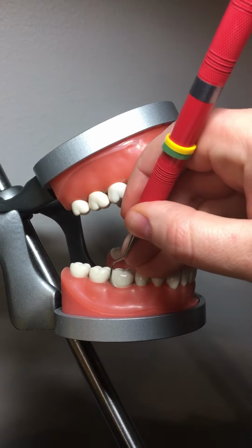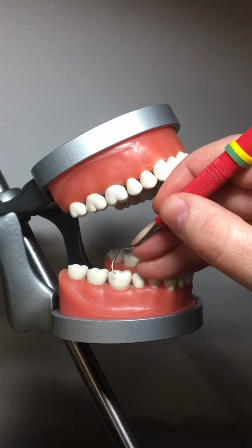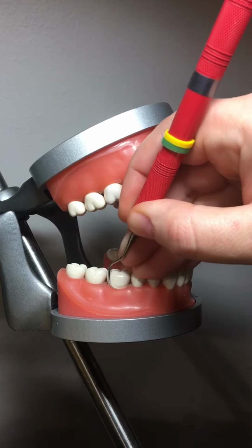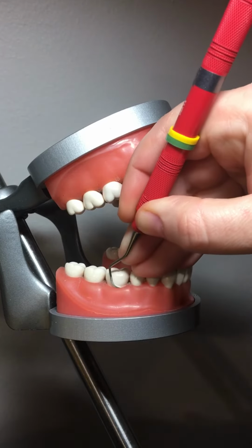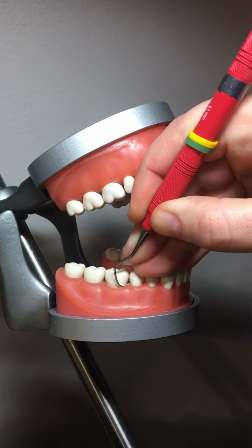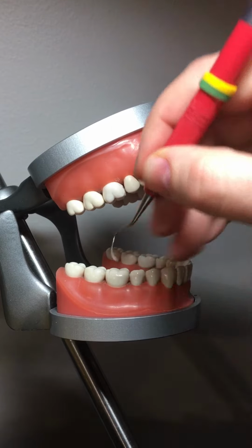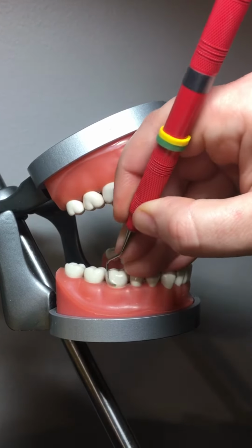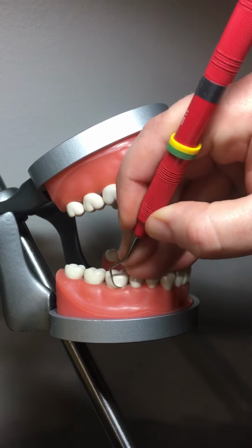And as hygienists, we like to know the definition of short. So I tell my students 1 to 3 millimeters, and you want these strokes to slightly overlap each other as you move across the surface. So here is our vertical stroke, short biting stroke.